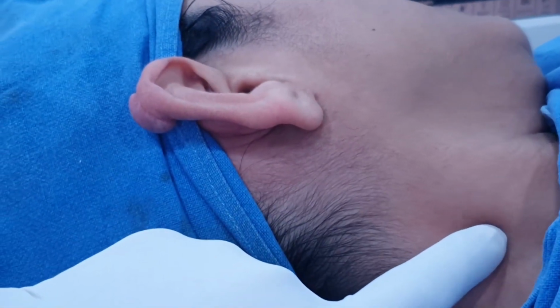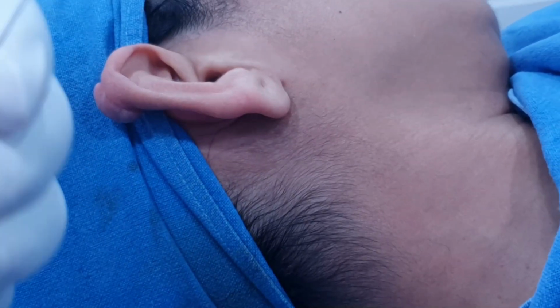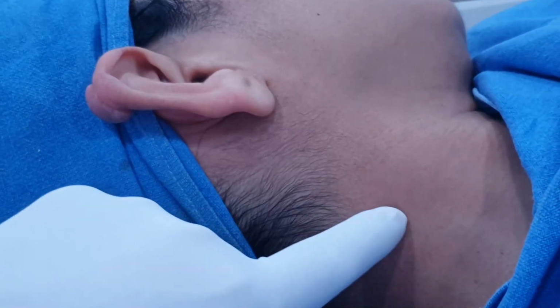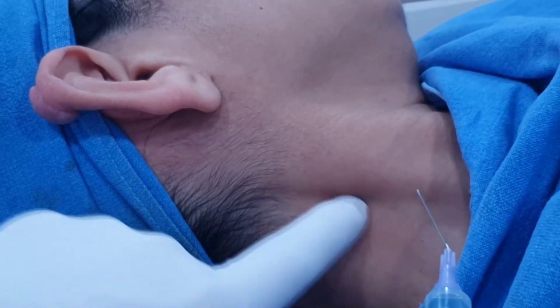So this is the posterior border of the sternocleidomastoid here. You can notice the external jugular vein here. So I am taking 5 ml of local anesthetic solution, and this is the sternocleidomastoid. And this is the external jugular vein.